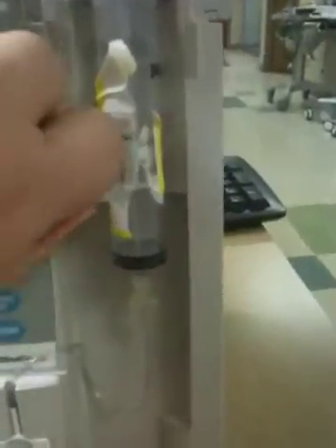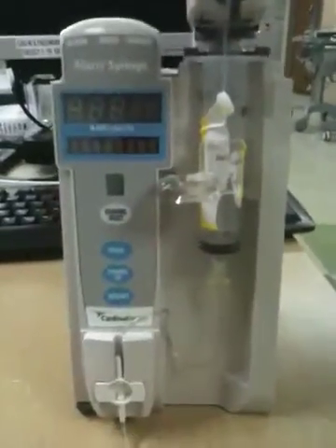Then you just set it up. You've got your tubing primed. Bring this down to lock it in and you're ready to go.